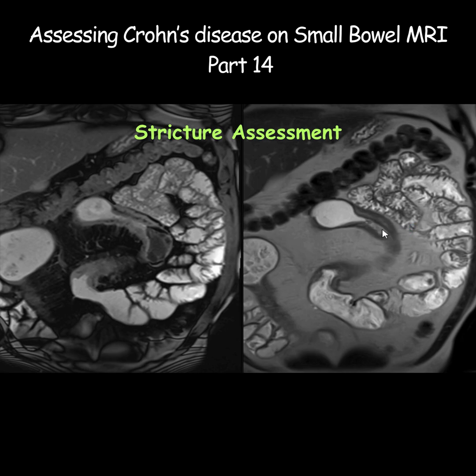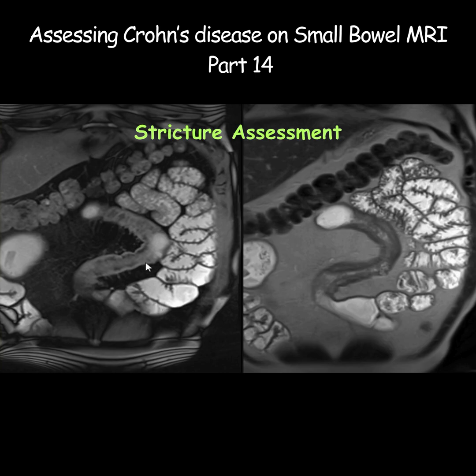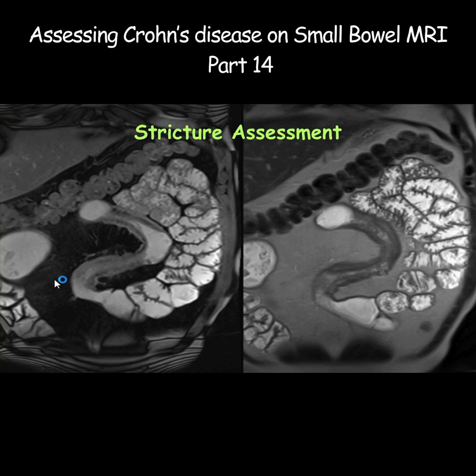Let's look at this area. There is some intermediate to bright signal in the center, and then low signal more towards the inner and outermost layer of the small bowel wall. This central part has shown a drop of signal, which is because of fat. This area, which has become even more bright with fat suppression, that's edema. Similarly, you can see some fat signal and then edema on top of that on this segment as well.